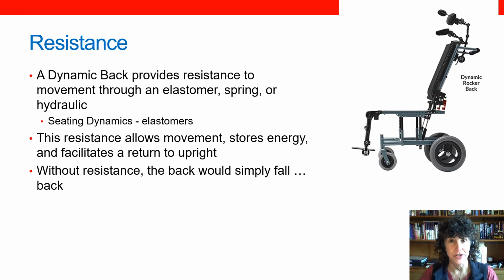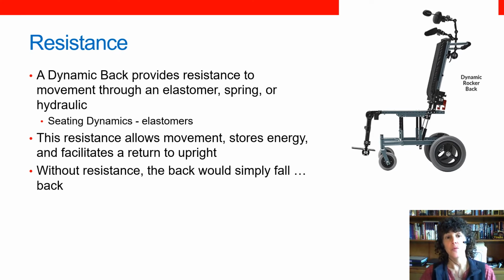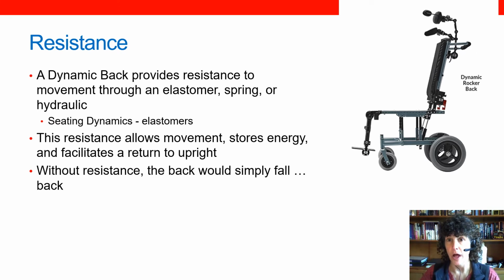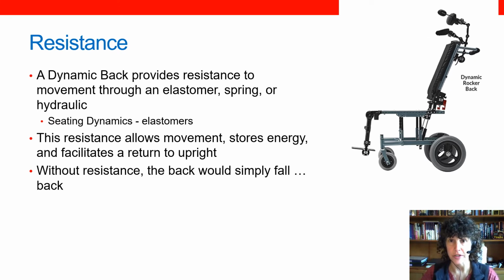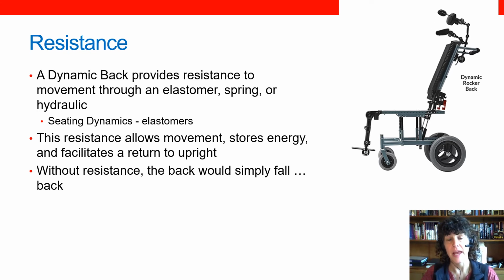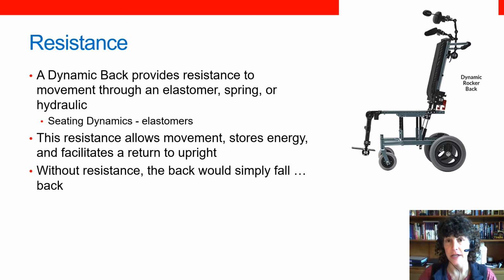So what is resistance? Well, resistance is designed to allow the client to move a certain distance and then encourage the client to return to an upright position. And this is provided in a dynamic back either through elastomers, springs, hydraulics. In Seating Dynamics case, this is through an elastomer.